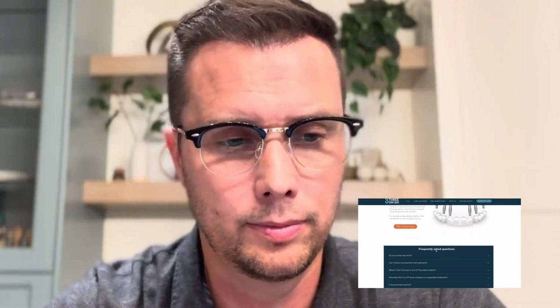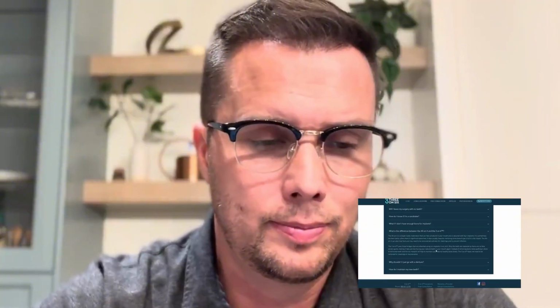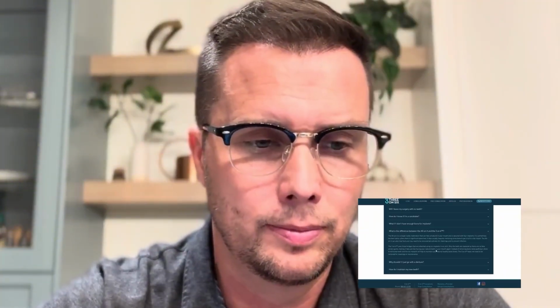And then they don't give any idea on pricing. They've got all these questions which they answer, the FAQs at the bottom. And it says the All-on-4 is a larger, bulkier thing, feels unnatural. I would completely disagree with this. For all the patients who we do this for, we make it as thin as possible. And I've never had a patient complain that the final set of teeth is too thick.